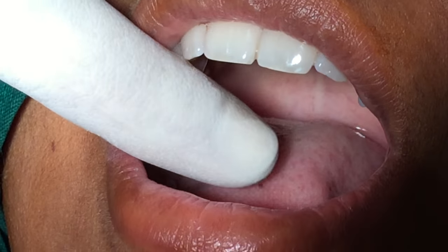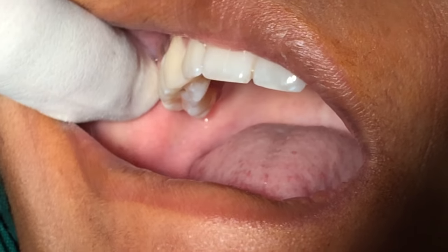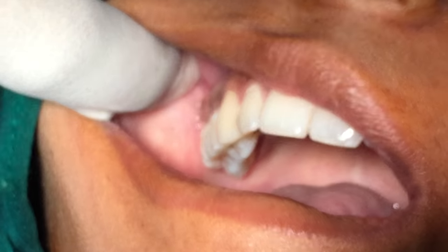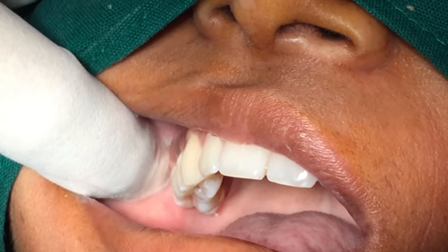Now we will be demonstrating the Posterior Superior Alveolar Nerve Block, which is used for extraction of multiple teeth in the maxilla in the posterior region.